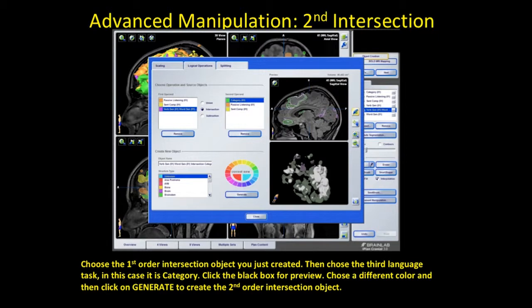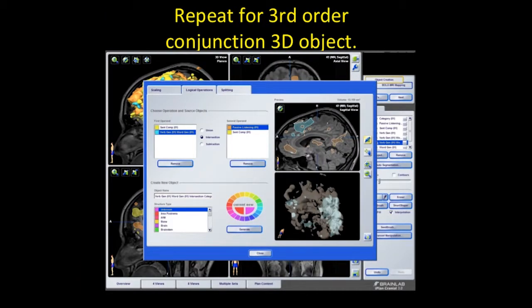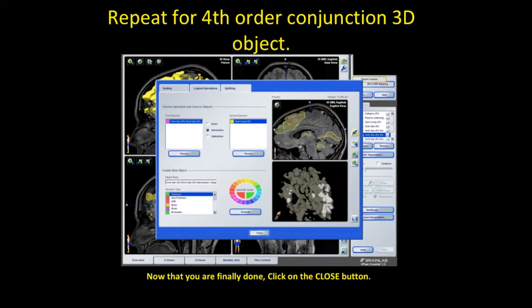For the second intersection, choose the object we just made — the first-order intersection object — then choose the third language task, in this case category. Click the black box for preview, choose a different color, and hit generate. Repeat again for the third-order object — choose a different color and hit generate. And one more time for the fourth order. Now that you're finally done, click the close button.